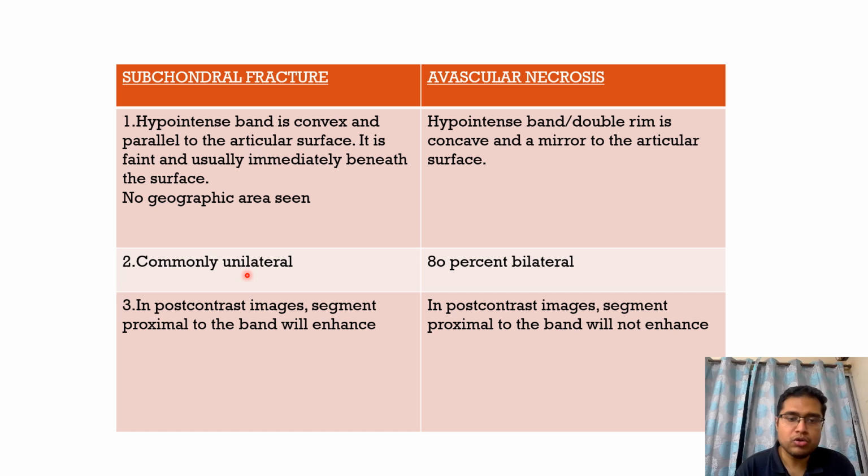On the post-contrast images in subchondral fracture, the segment proximal to the band will enhance, while in case of avascular necrosis, the segment proximal to the band will not enhance because it is necrotic.